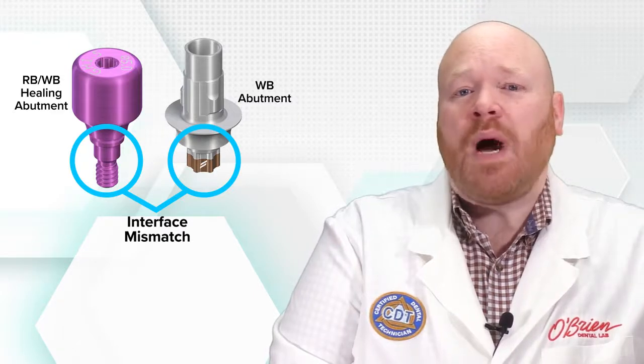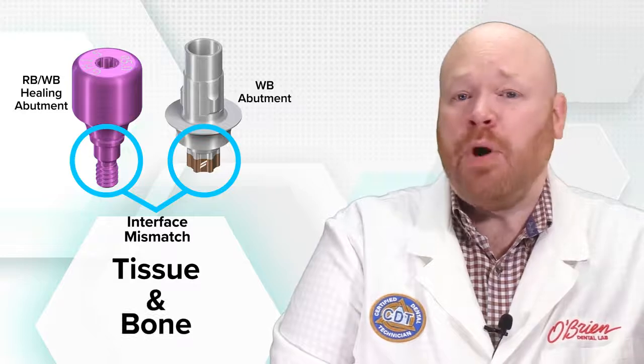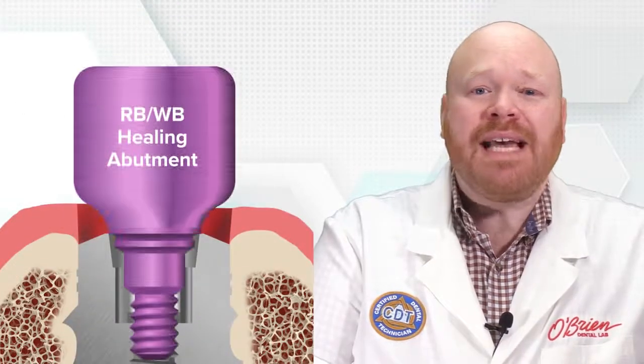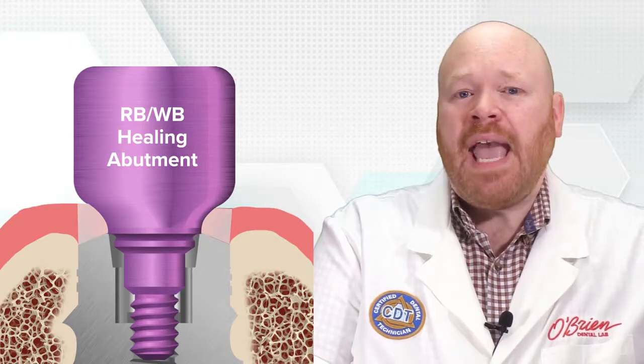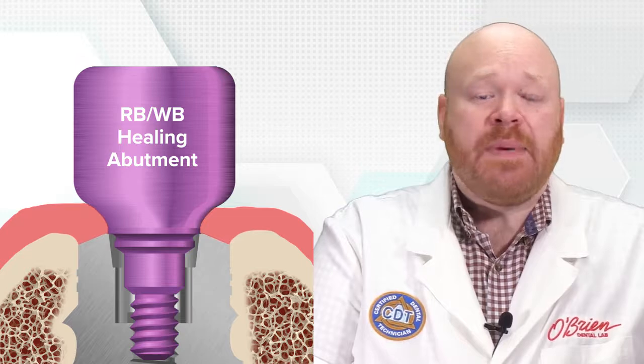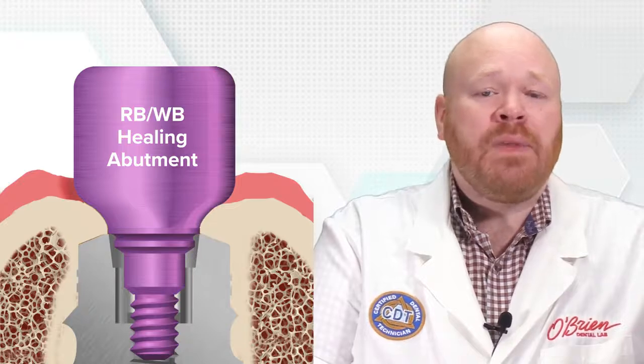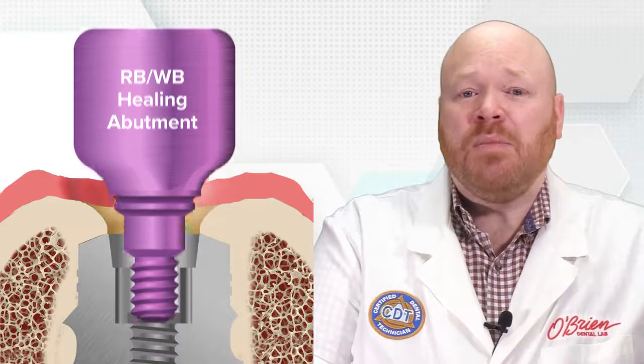And there's two reasons why that mismatch could prevent the abutment from seating: tissue and bone. When the RBWB healing abutment is placed, it leaves a nice little space at the interface. And if the top of the implant is at or above bone level, tissue is going to grow into that space really quickly. And if the implant is subcrestal, bone is most likely going to grow into that space eventually. So when it comes time to seat that WB abutment, you're going to have a hard time unless the tissue or bone that's holding it up is removed.